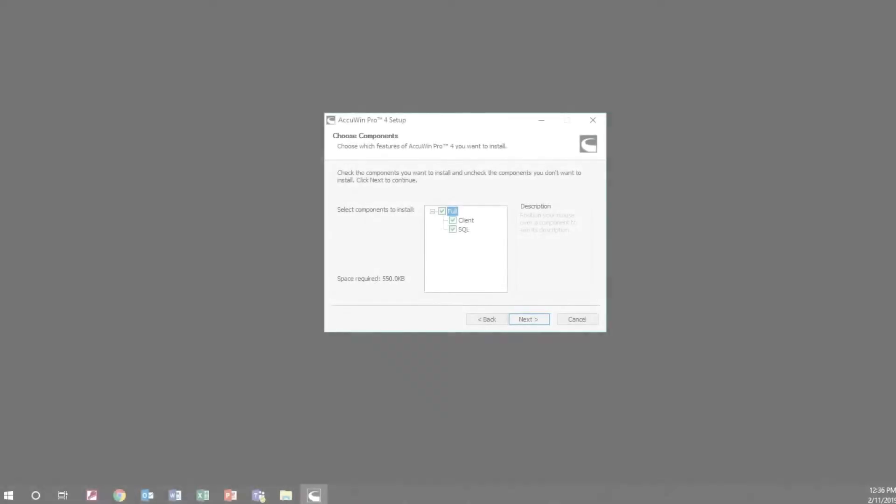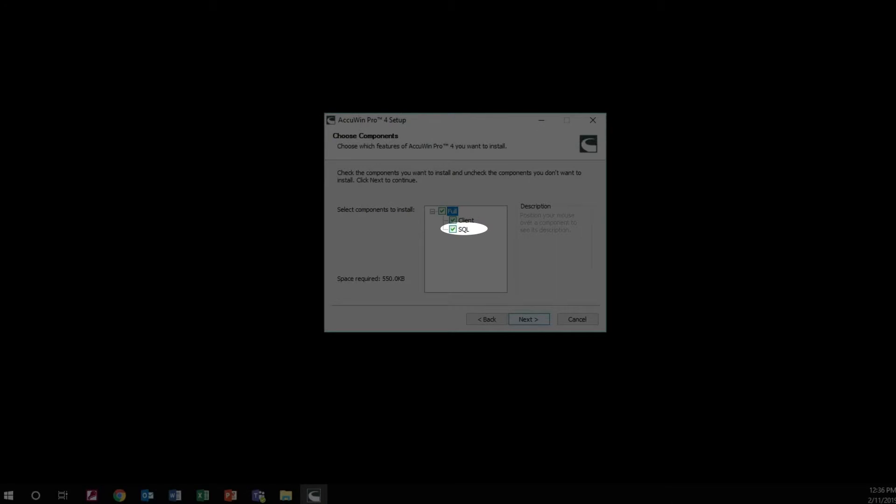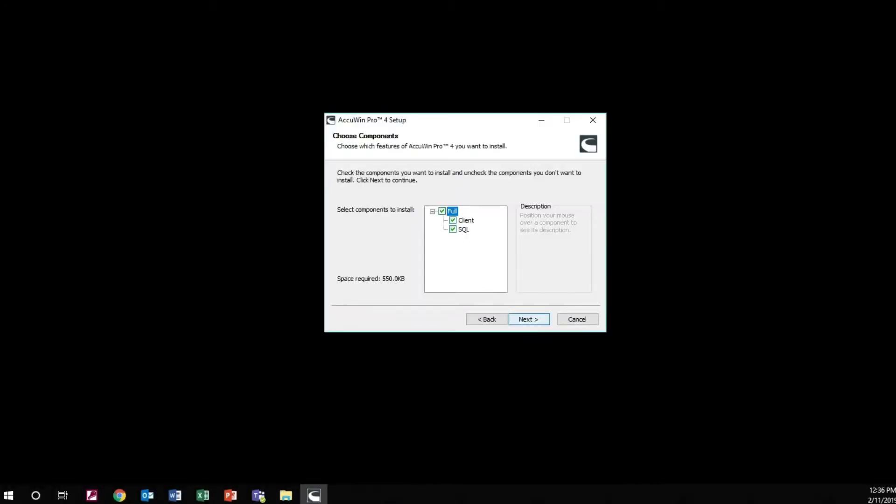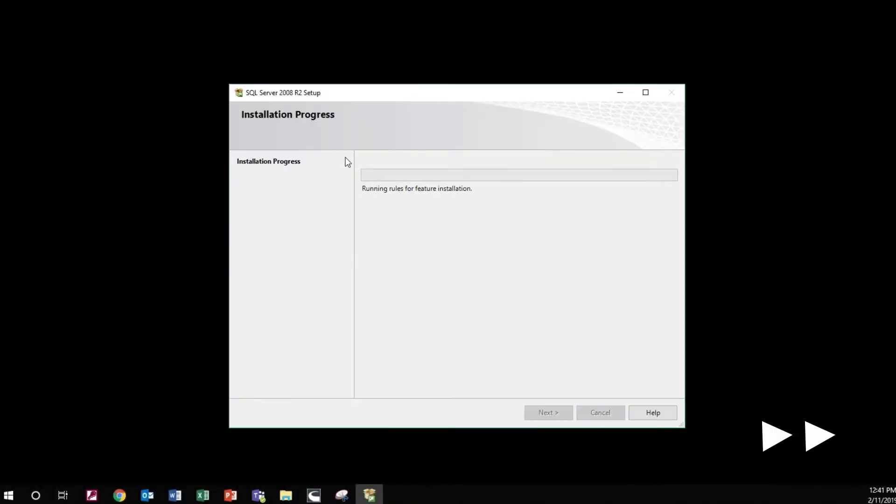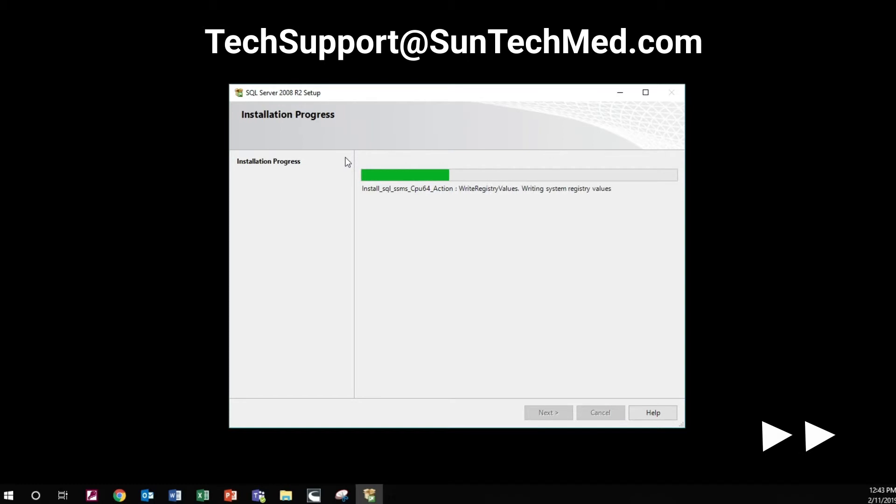The SQL server can also be installed remotely to allow access from multiple workstations. If multiple workstations are to be used, the server installation should be run first on a remote server. The client installer should then be run on all workstations where AccuWin Pro will be required. Contact SunTech Technical Support if you have questions.